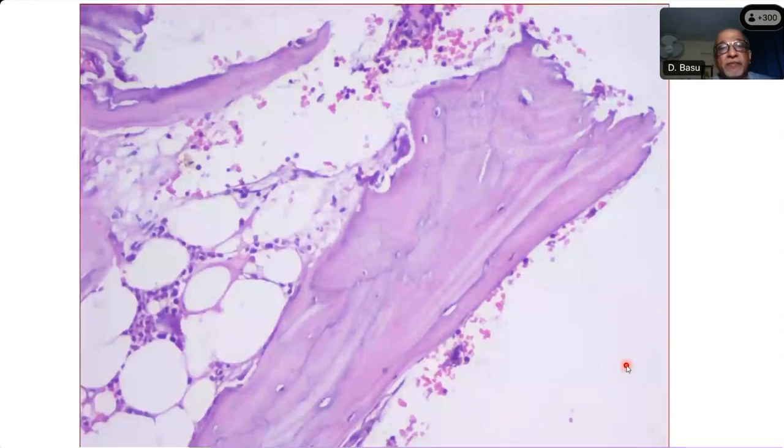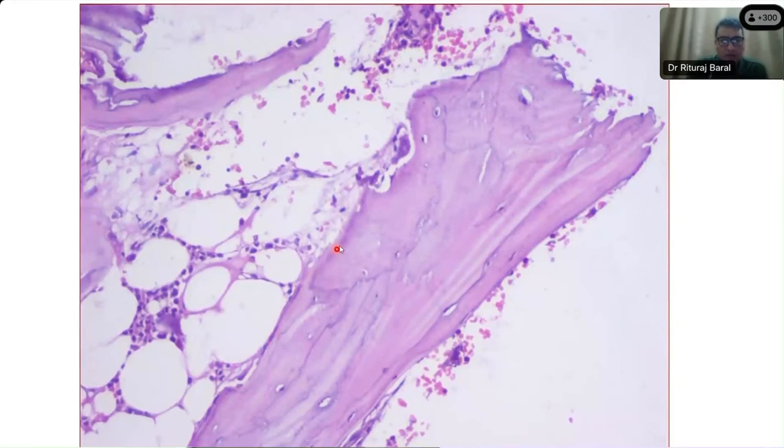The bony trabeculae are somewhat eroded, sir. Yeah, right. It's not regular. Very good. It's eroded, scalloped. A little scalloping is there, and there are a few osteoclasts. Notice, even on the low magnification you can make it out. We generally use the Hammersmith protocol or the AZF fixative followed by formic acid. So that decalcification is quicker and morphology is well preserved. What you notice here is a very irregular trabecular outline, and there is a bit of scalloping, or what is the beginning of a tunnel.